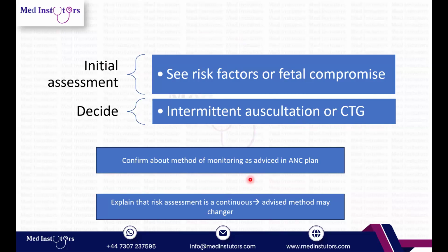Apart from our initial risk assessment, it is essential that we look at her antenatal care plan that has been given or noted down in her personalized notes. You have to explain, as I said earlier, that it is a continuous assessment, and any method might change at any time. It might be stepped up or escalated if she's on intermittent auscultation. I hope we're clear so far.